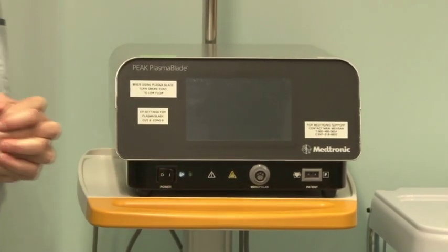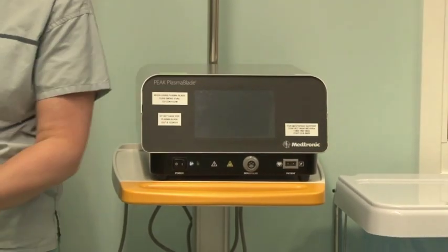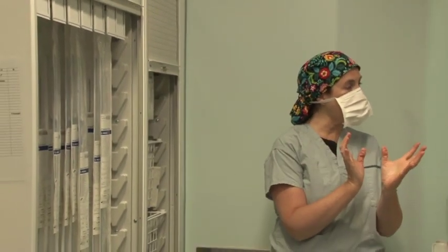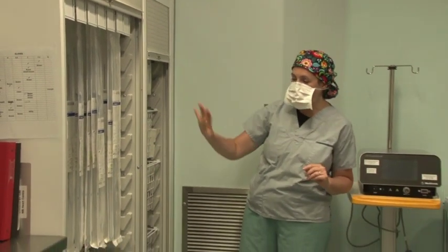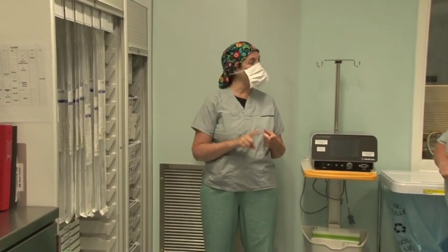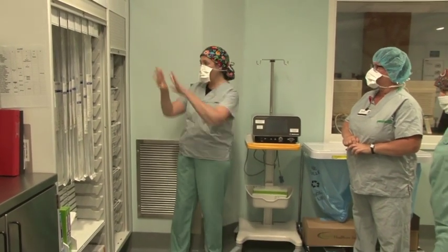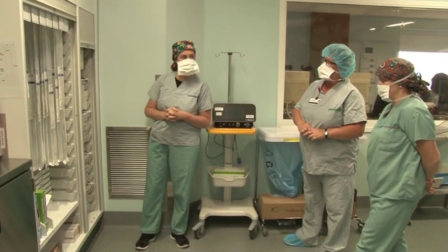Sorry, I might have missed it. What did you say this cover was? All of our supplies are here for bi-V pacing or bi-V ICD, when we're trying to synchronize the right ventricle and the left ventricle together. This is for everything that we would use for an LV lead, and that can be connected to an ICD or just to a pacemaker. These are all of our LV supplies for that replacement.